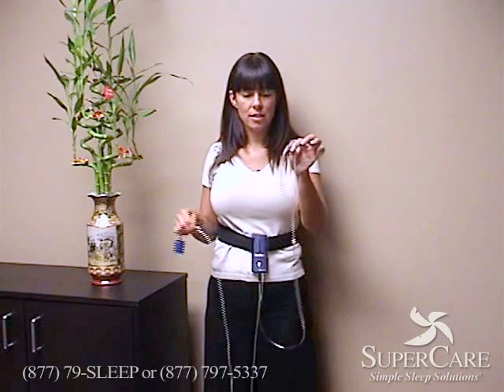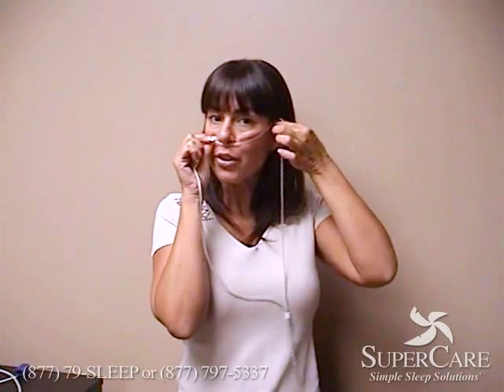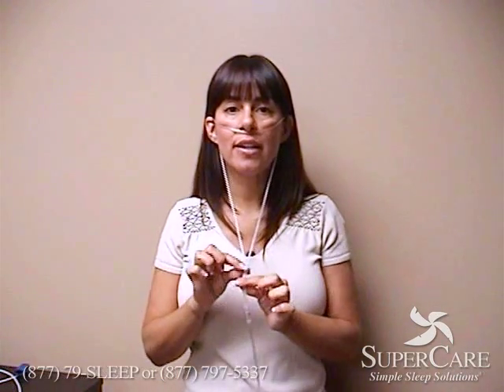Then put the cannula on next. Take the cannula out of the bag and when you're ready to put it on, make sure that the prongs are facing downward. Those will slip right in your nose and then the ends just go right over your ear. This helps tighten or loosen the cannula to ensure comfort.